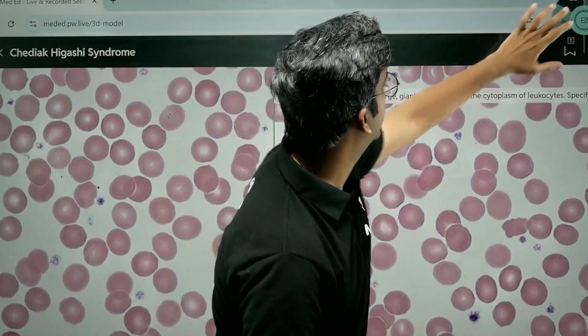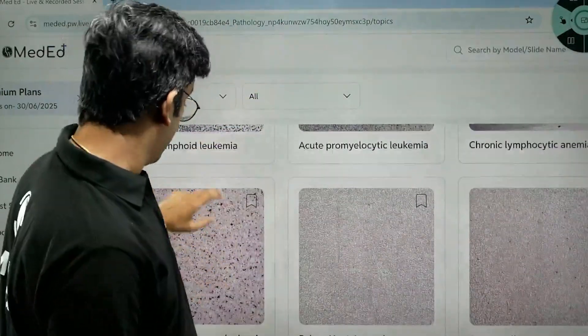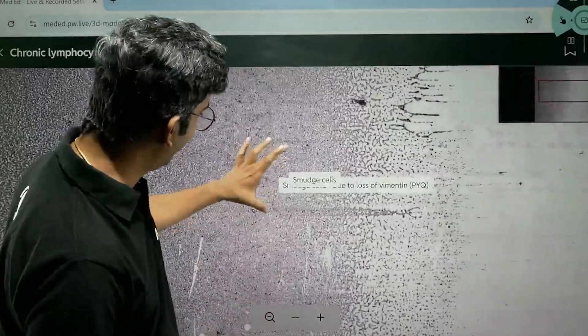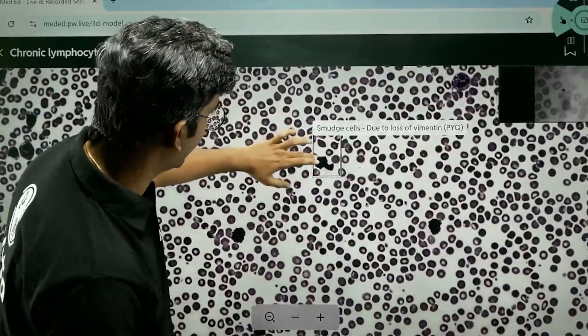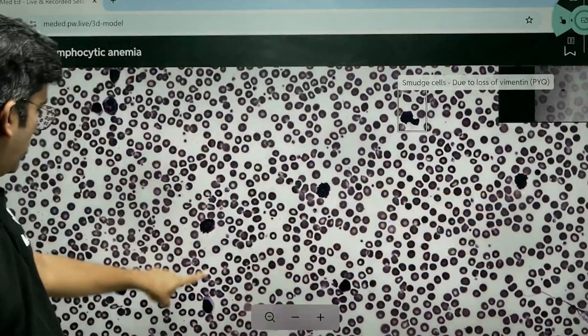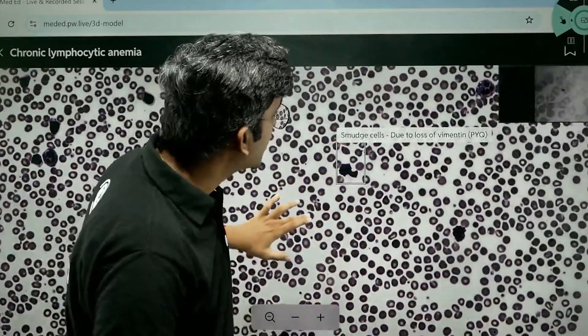Let's go back and go to a WBC disorder — we've been hanging around RBC disorders. Let's go to WBC disorders. CLL is obviously one which I'm sure you've seen, learned, and memorized. Look at that — that's a smudge cell. Not just one — one more smudge cell, one more, one more. Smudge cell is just a destroyed WBC. It's written that smudge cell is due to loss of vimentin — that's a PYQ which came in the exam. So it's an abundant source of information.